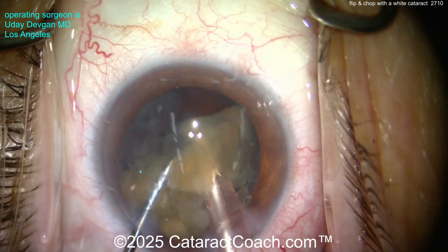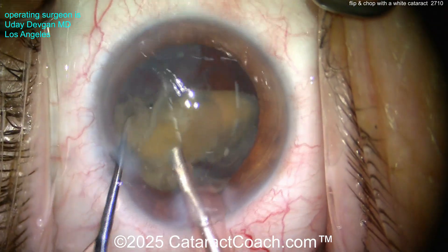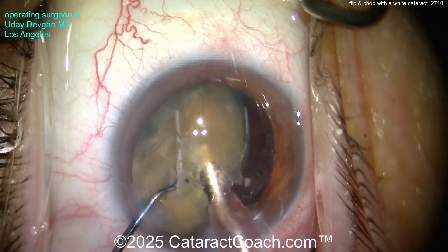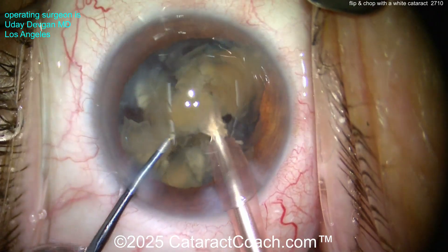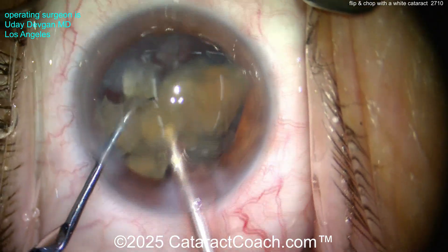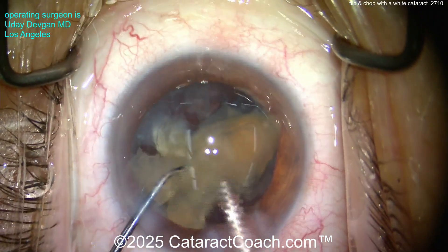As we know, in these denser cataracts that posterior plate can be more fibrous and tough to split if you're operating only from the front. Whether you're doing a groove down the middle — like stop and chop or divide and conquer — you get that deep groove and the pieces still don't want to split. Here we're directly attacking that posterior surface, breaking that posterior plate. Look at that nucleus already cut into a lot of small little pieces.